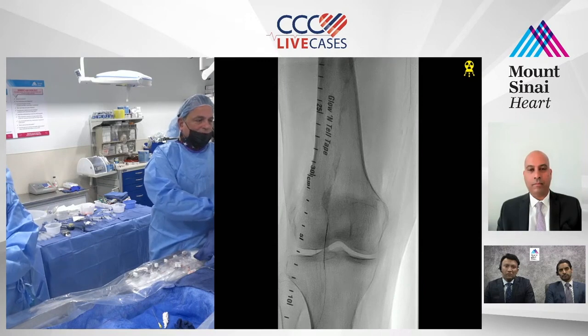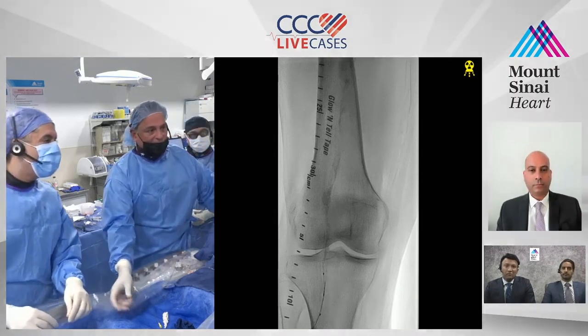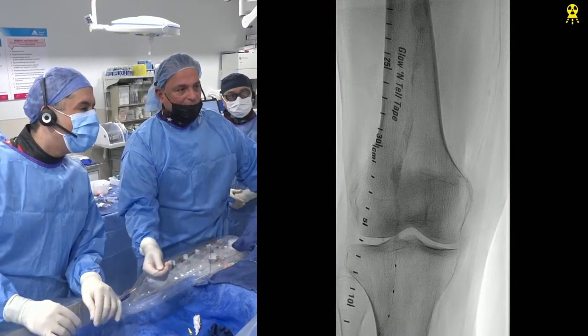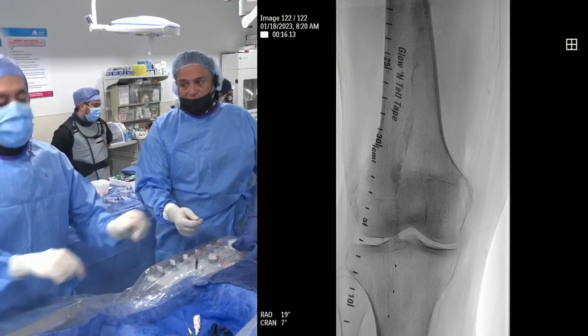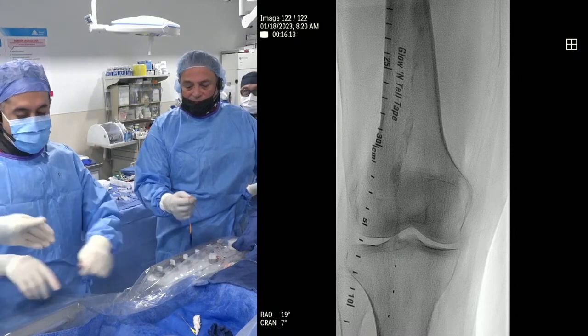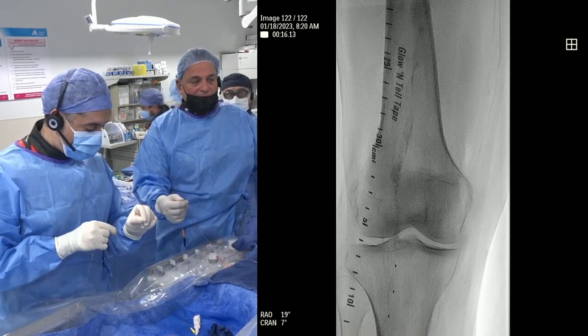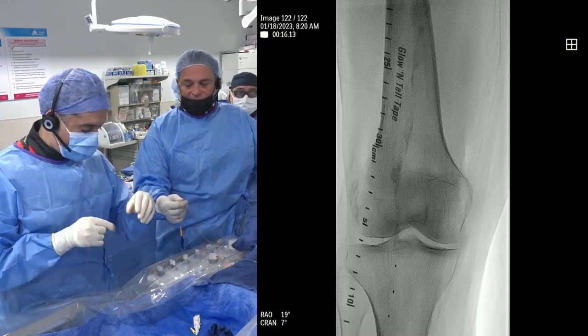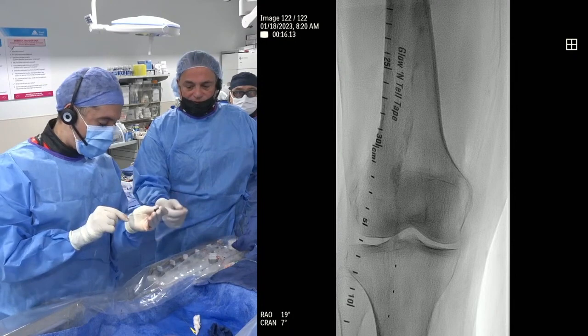Believe me, we do very little pedal access. I think we've done one case last year with a sheath in the pedal. And that was a live case, so 2 years ago. Generally, we do not put sheaths in the leg. I mean, Ajit knows this. And we will if we have to in these kind of cases. So I think this is one of those where I think we're going to be fine. I really do. I just think we're going to add a cocktail through the side port of the sheath.